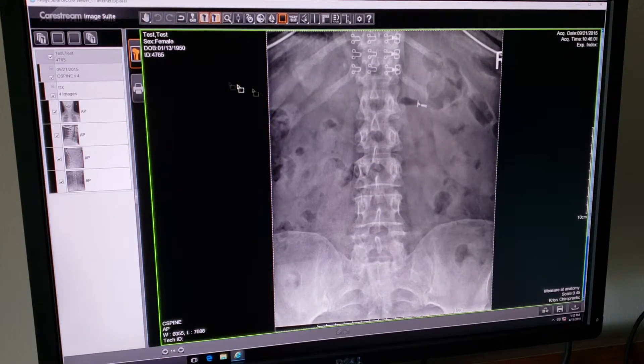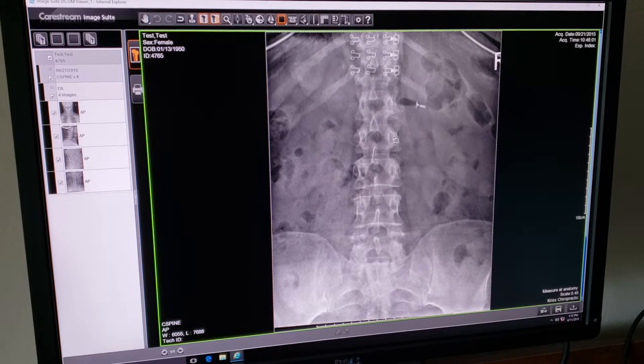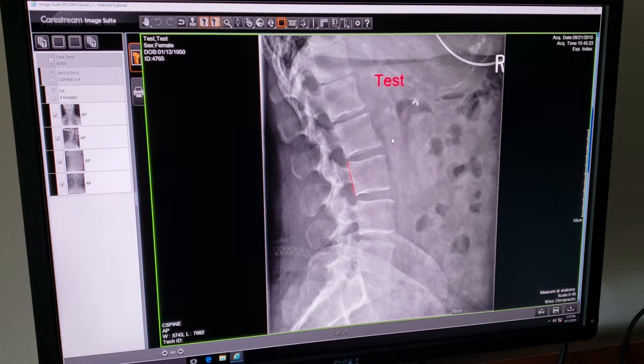I'm going to reset our image one more time. The next toolbar has some really nice chiropractic tools, so we'll go up to the lateral cervical.